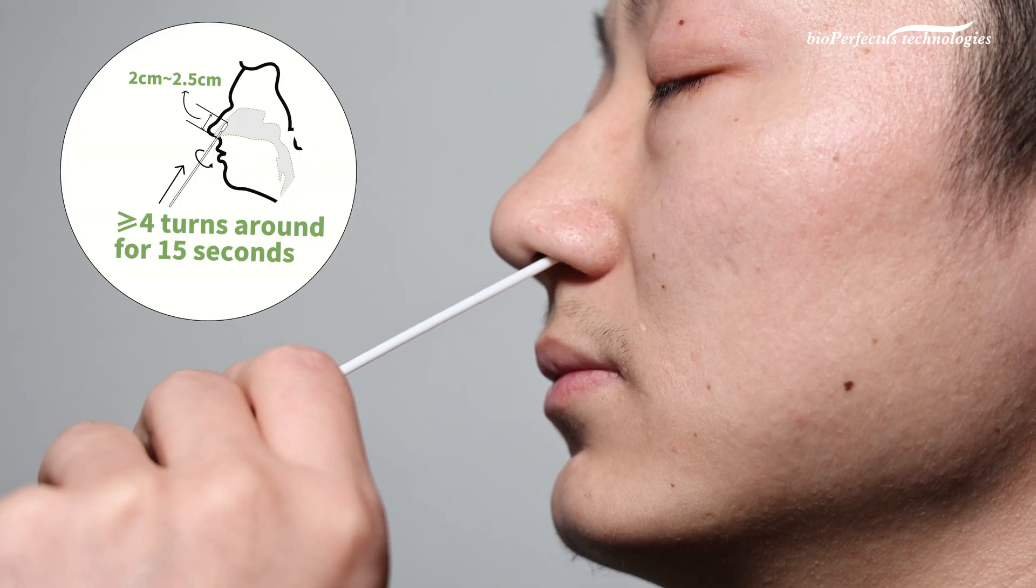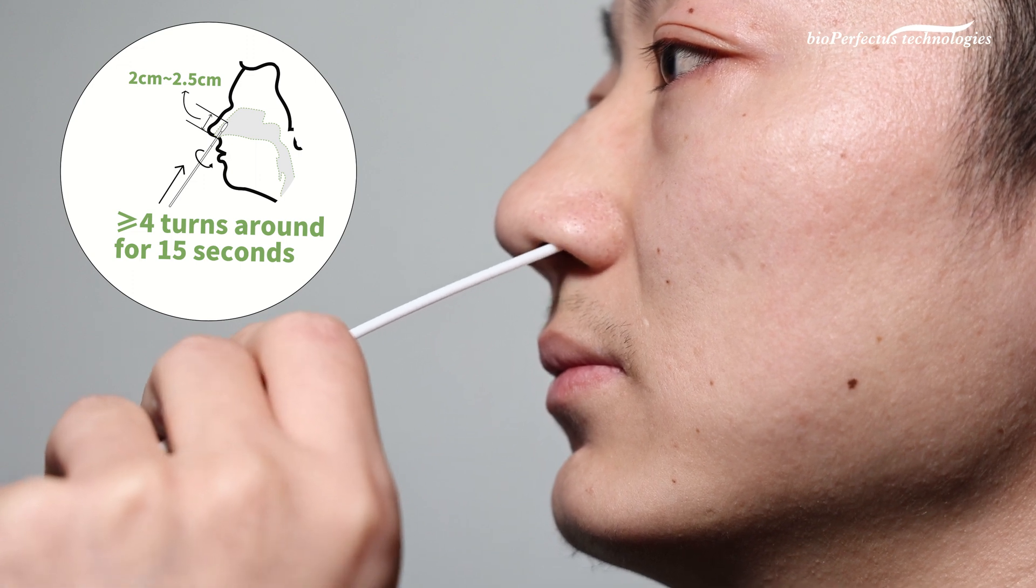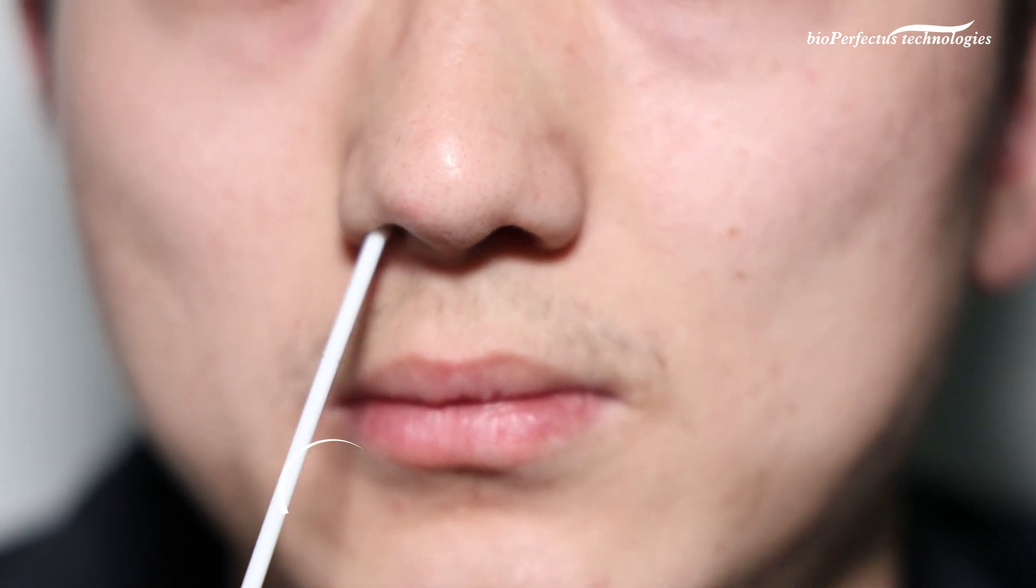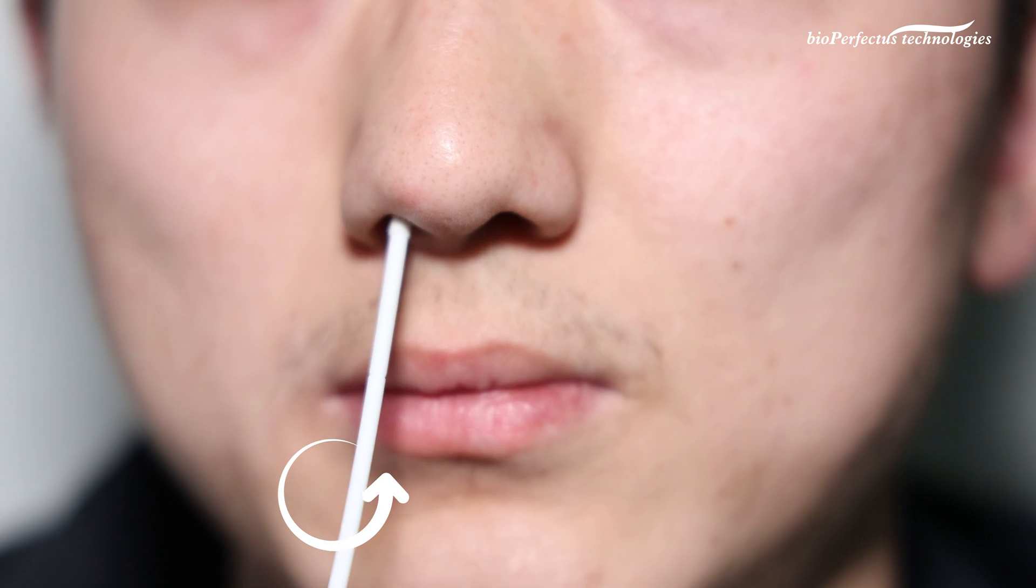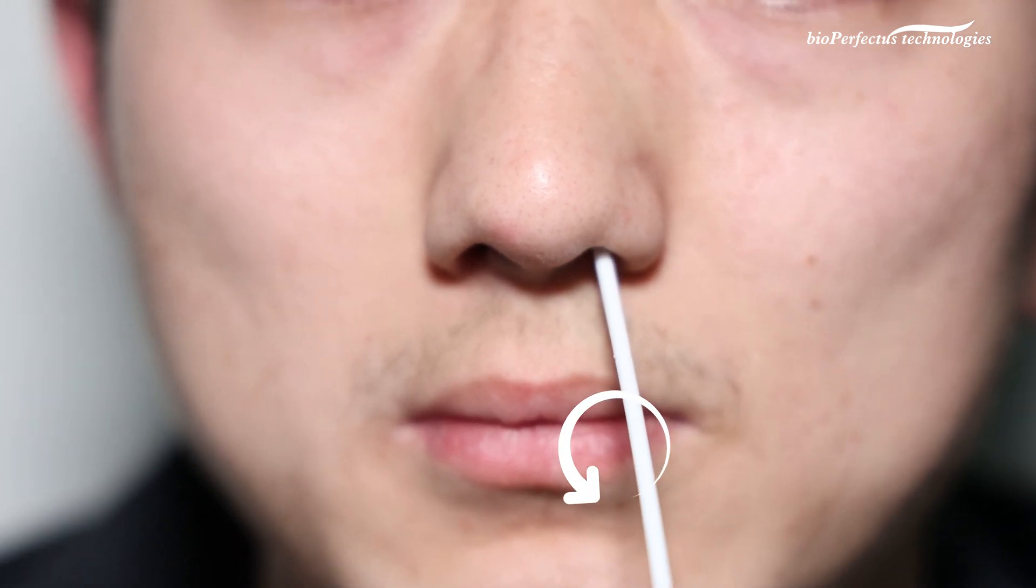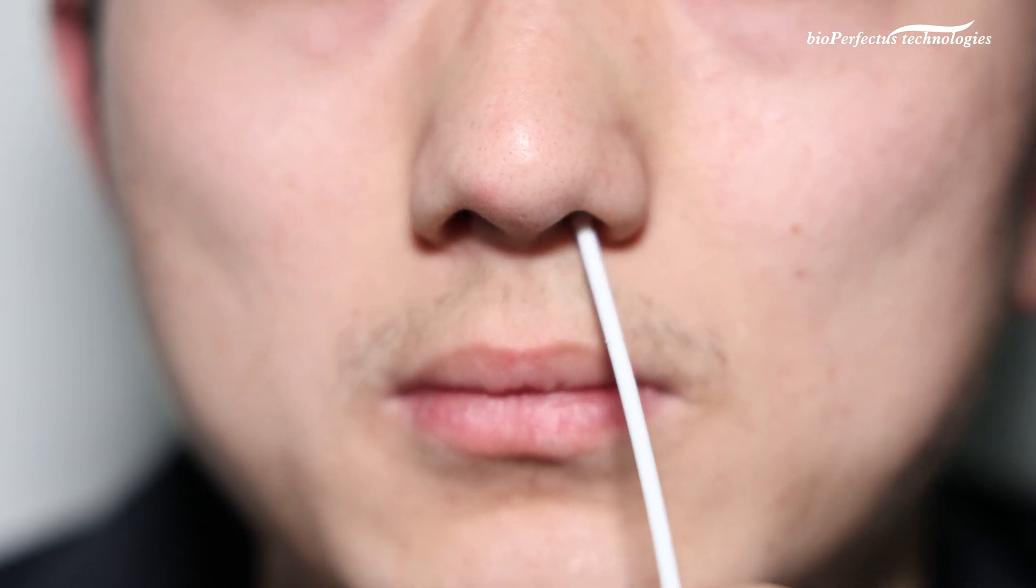Slowly insert the entire swab head into one nostril until you meet resistance, usually it is 2 to 2.5 centimeters depth, depending on the size of the person's nose. Rotate the swab at least four turns for at least 15 seconds around the inside walls of your nostril. Repeat the steps in another nostril. Remove the swab gently after finishing the collection.